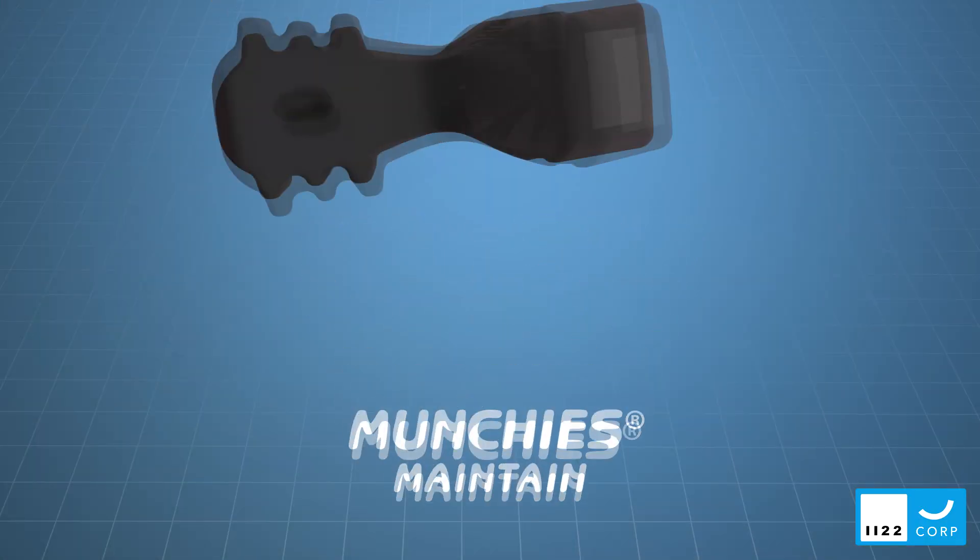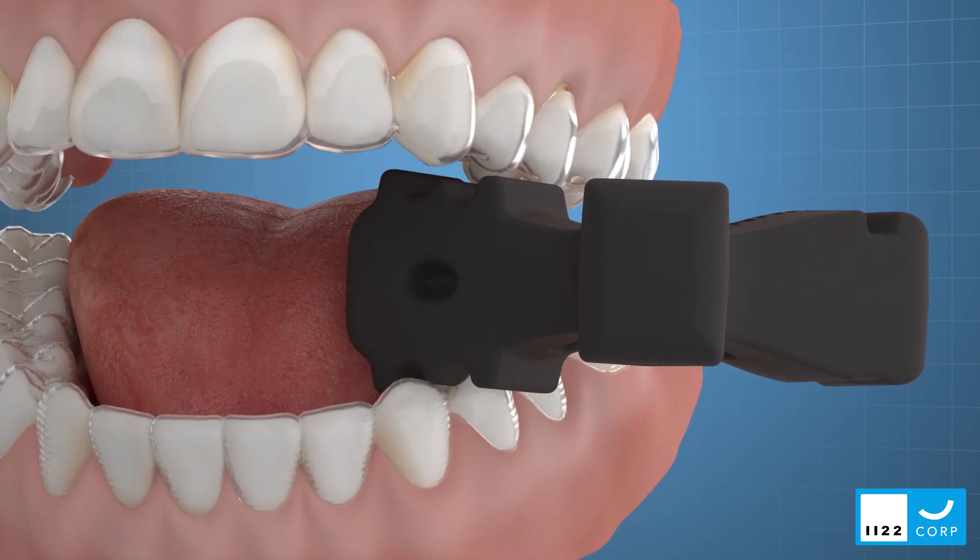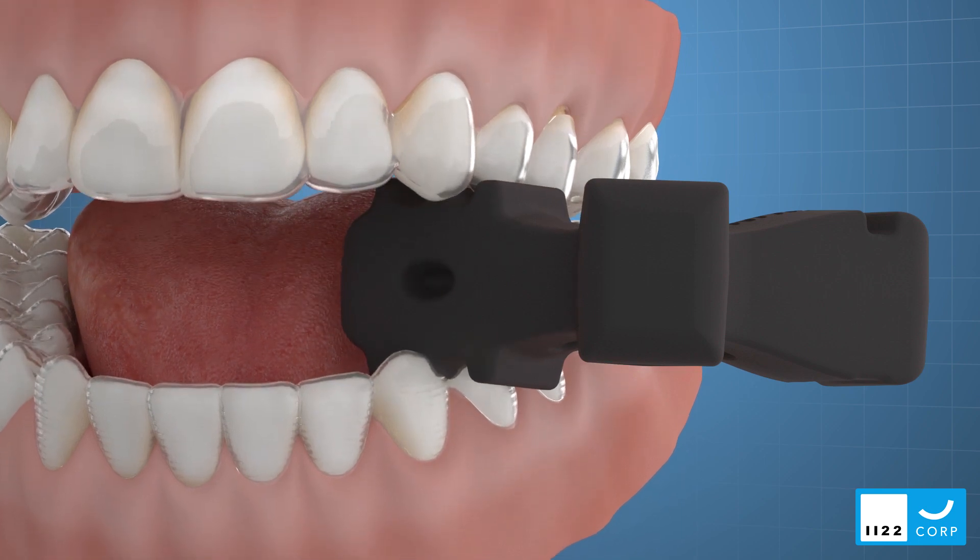Munchies Maintained devices have been designed to optimize the seating of clear retainers after your patients have completed orthodontic treatment.